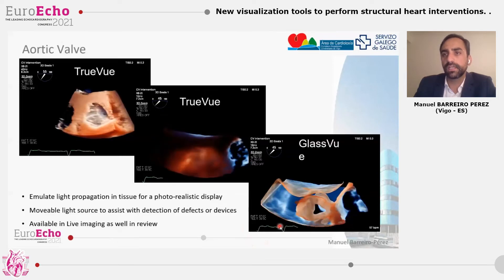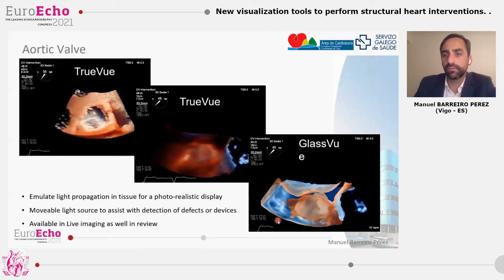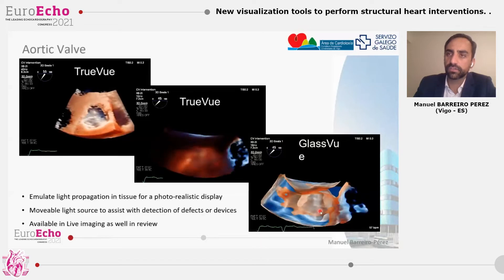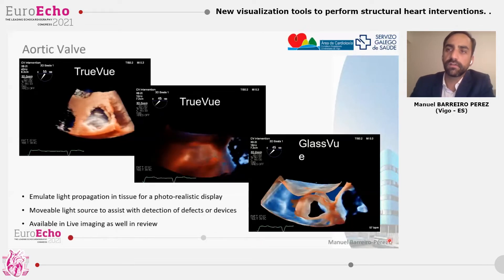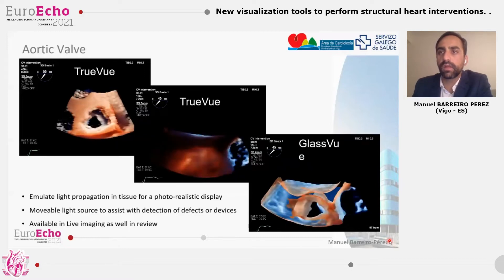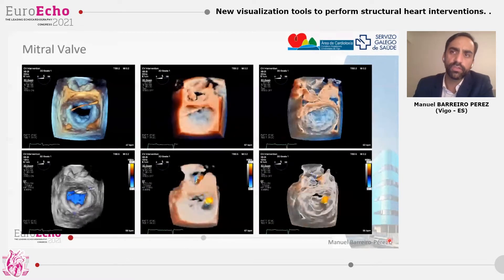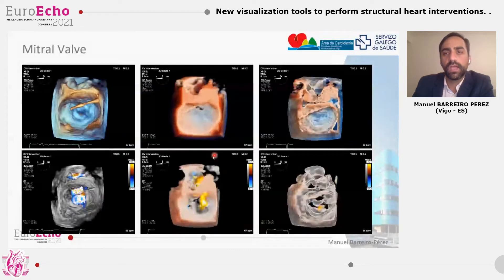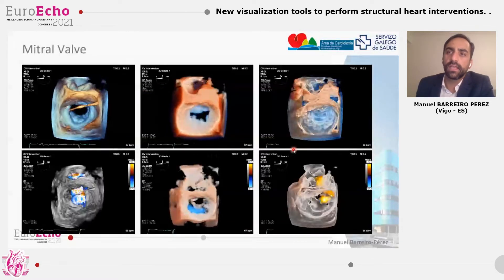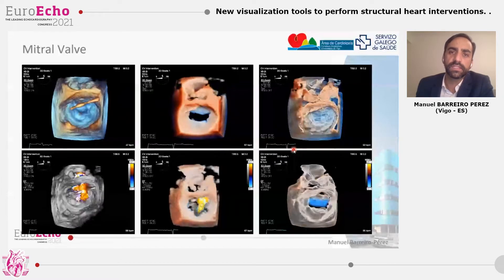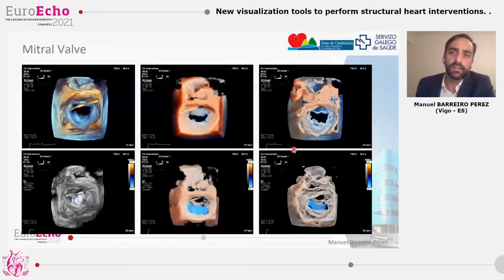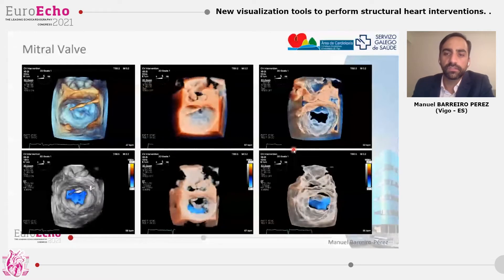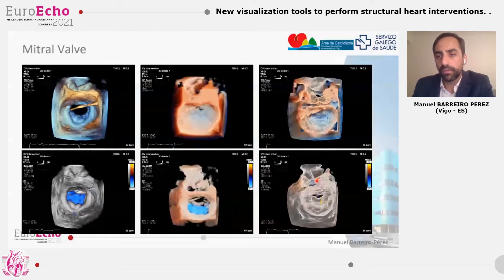With the glass view, this transparency option erases background information and keeps just the edges and borders of the image, enhancing the edge reference of the structures and providing an external view of a structure. On the mitral valve example, we could compare the classic renders without and with color, the true view and the glass view. It has been published that with these new renders, it's easier for readers to identify defects in the anatomy of the mitral valve and to identify the location, number, and severity of the jets of the mitral regurgitation, especially with the glass view.